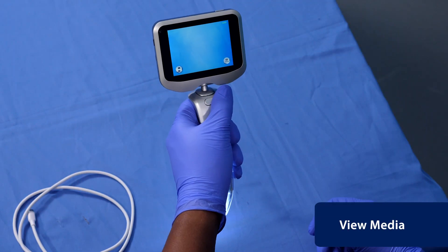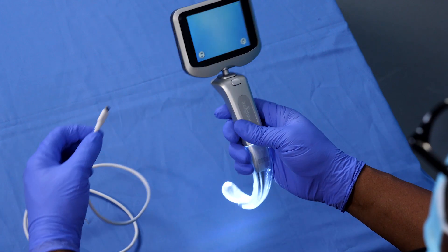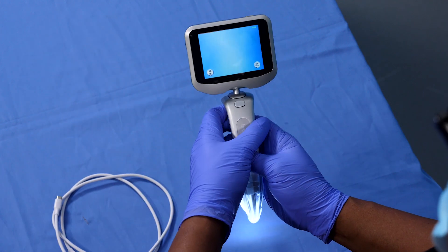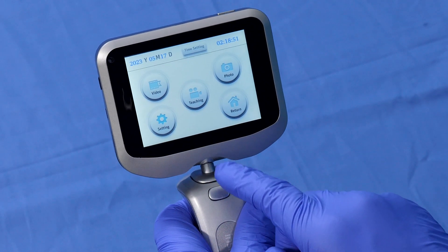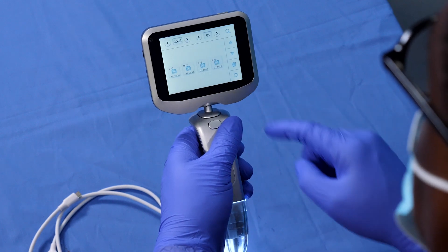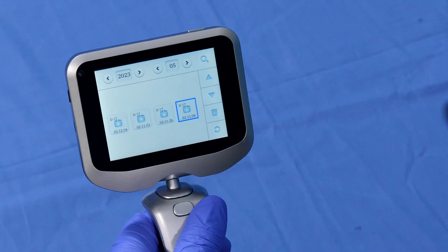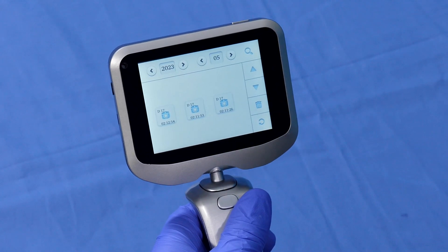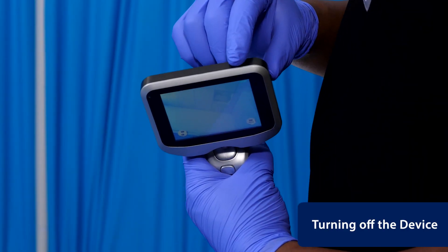To view and manage the photos and videos on the video laryngoscope screen or on the computer via micro USB cable, press the inside menu button on the screen. Press the photo or video button to review and delete the photos and/or videos taken. To turn off the device, press and hold the power button until the screen shuts off.